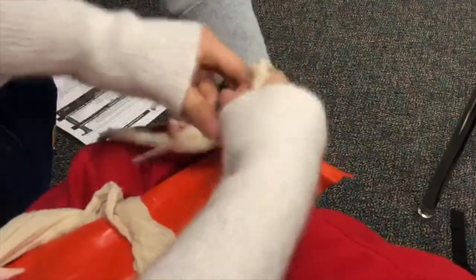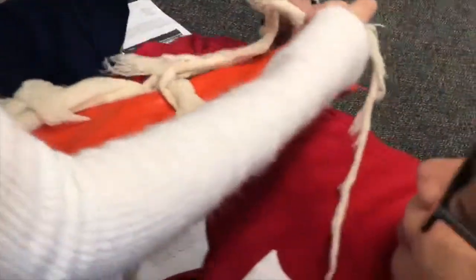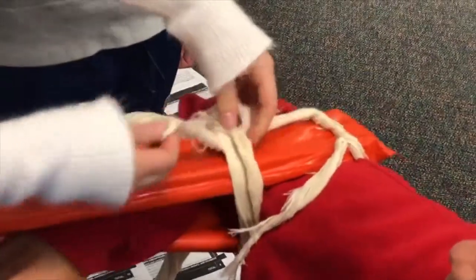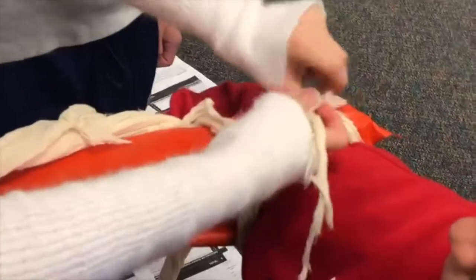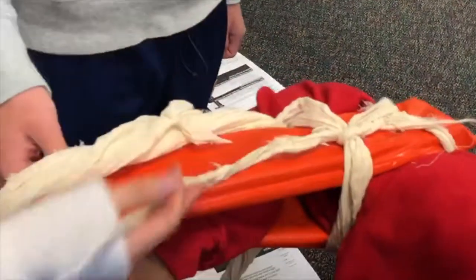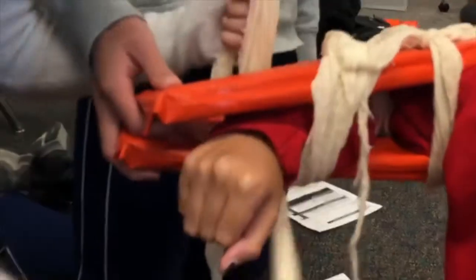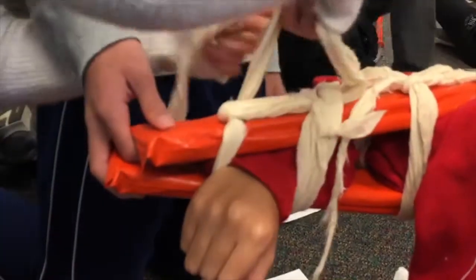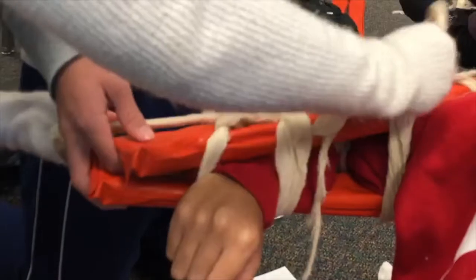And you're going to do a surgeon's knot — which is three loops around. Then take one side, it doesn't matter which one, and tuck it under. Then do another surgeon's knot. Now do the same exact thing: hit them in the face, cross under, go over this way — not over this way, because it's not stabilizing. Do a surgeon's knot, go under, do another surgeon's knot.